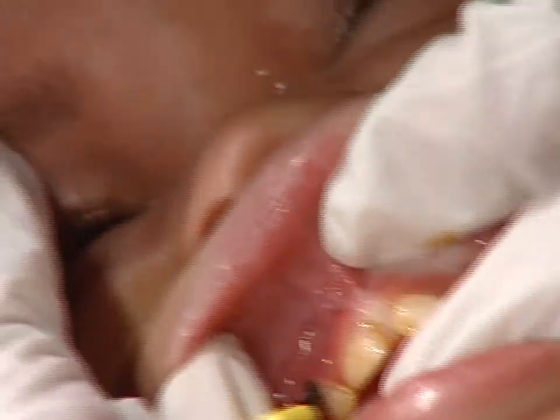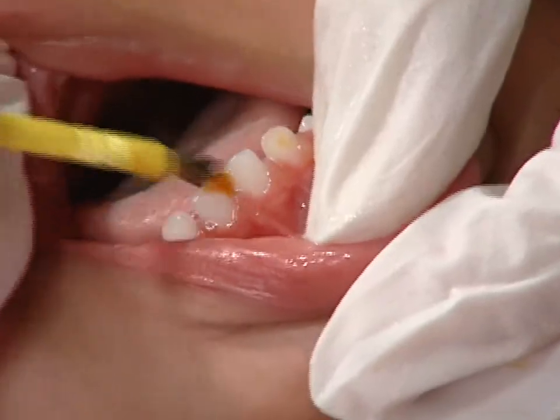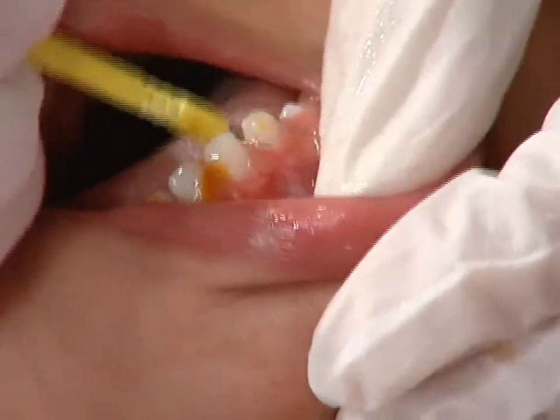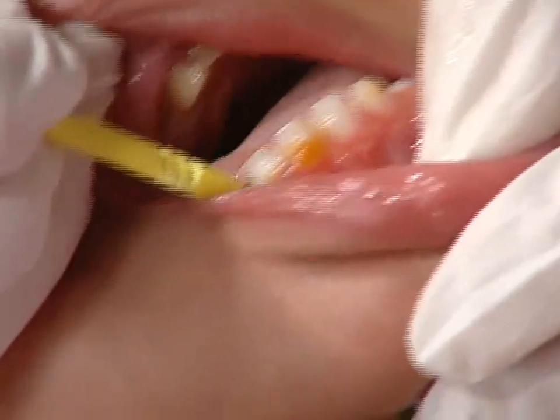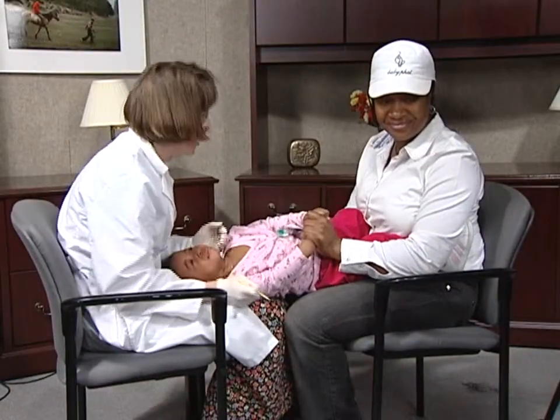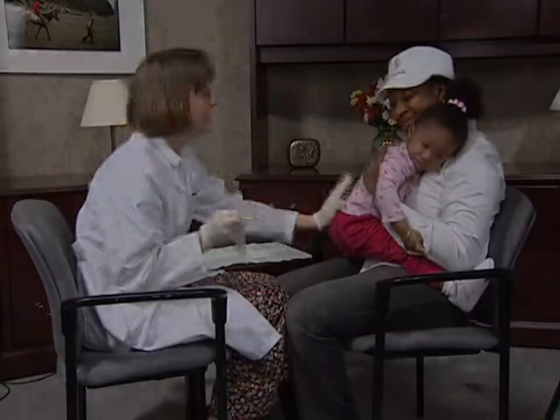We are using cavity shield varnish here. Young children often cry when this is done, but this means their mouths will be nice and wide open. Now dry and paint the bottom teeth. Here it would be helpful to use your finger to keep that tongue out of the way. When finished, clean her face and sit her up.